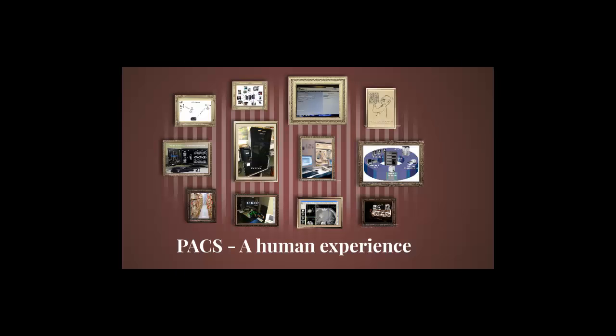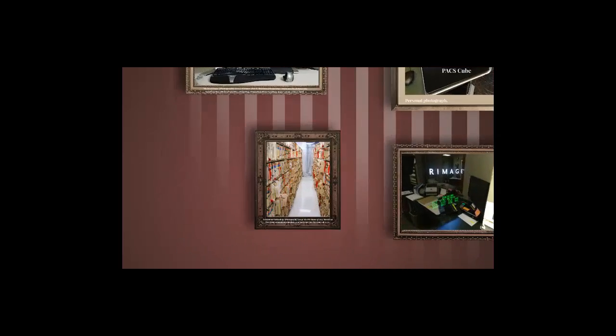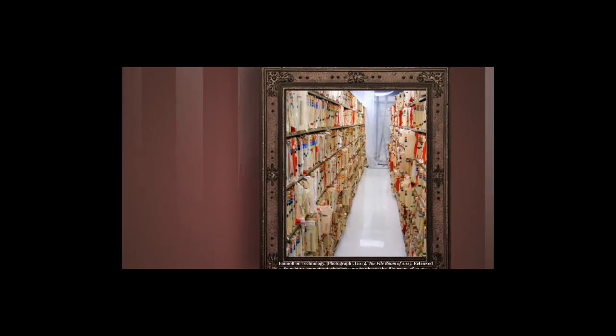Supervisor here at this outpatient imaging center. I started working before there was a PACS. It was just film, and it was very tedious to keep up with. To keep those archived, you had to print out the images on film and keep those in jackets stored.